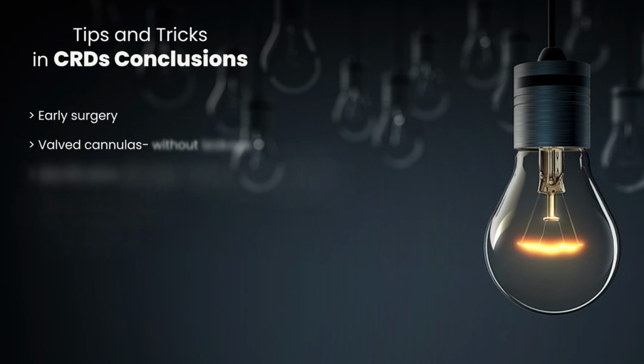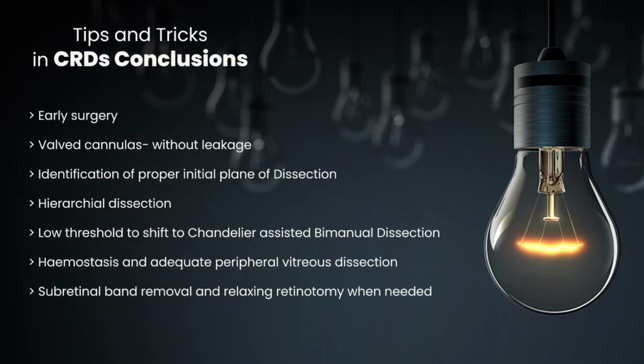To conclude, it would be apt to say that though cases of CRD can be extremely challenging, a proper understanding of the presentation and anticipation of the possible difficulties would definitely result in a better surgical outcome.